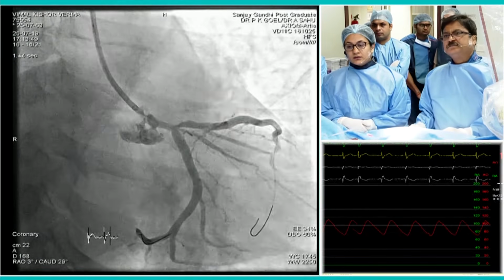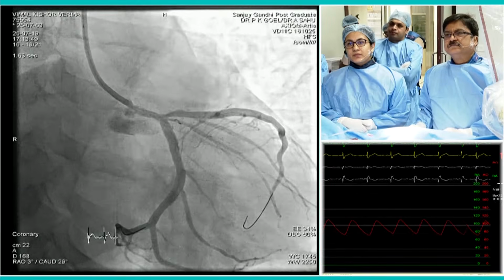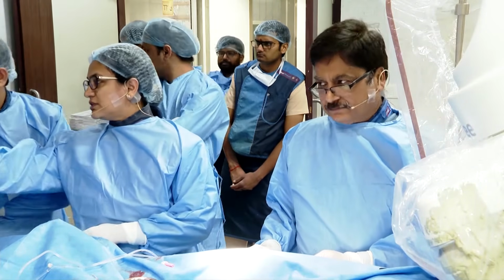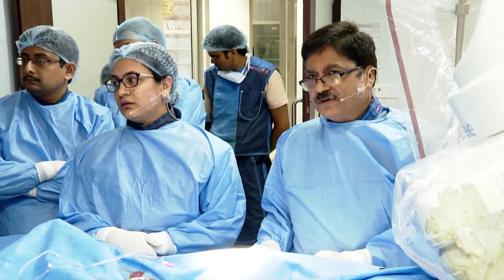One other quick question is, if you look at the ostial LAD in the left main, as both of you mentioned, there's not a lot of plaque, but there's negative remodeling of the vessel. Ostial LAD is negatively remodeled, a little bit smaller. Does that change your strategy in terms of sizing? How do you factor the plaque burden into the decision making?